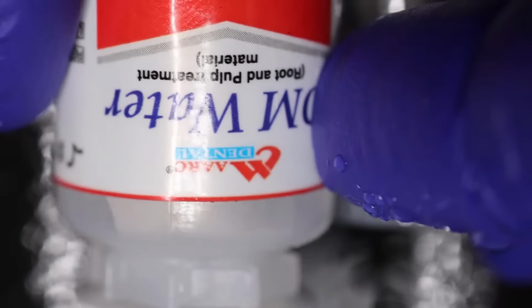We will take a clean glass slab. So over here we have taken this clean glass slab, if you can see this.